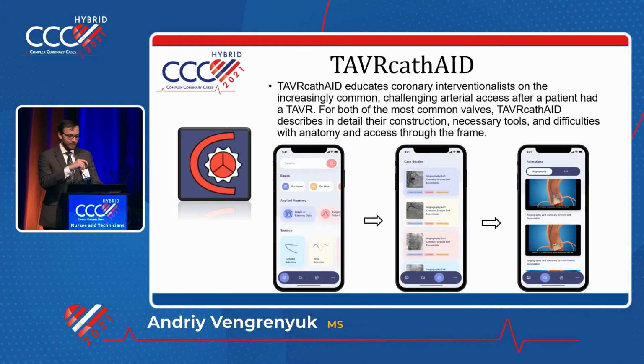So the basic section up here will discuss the balloon and self-expandable valves. The next section will help you understand how those valves interact with patient anatomies, such as the width of the coronary sinus and the height of the coronaries. And then finally, at the bottom, you can see how you select a catheter for a patient that's coming in with a pre-existing prosthetic valve. And also there are recommended escalation paths. So if one doesn't work, how do you proceed?